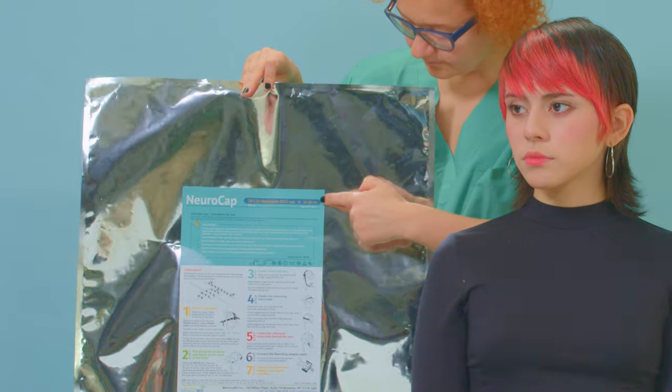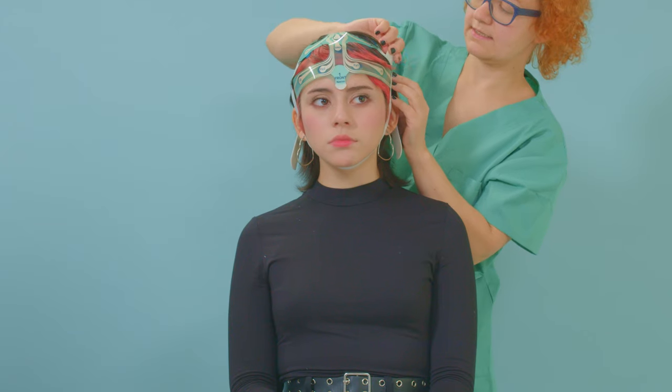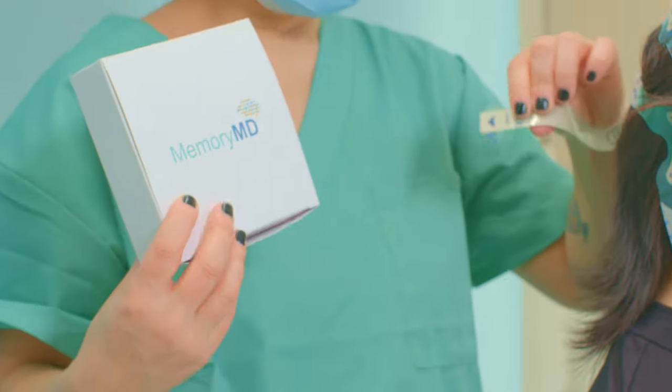Medical technology company MemoryMD presents NeuroCap: an easy-to-apply, single-use EEG headset with 19 channels and 22 pre-gelled electrodes located in accordance with the 10-20 system. NeuroCap is FDA-cleared to stay on the patient's head for up to four hours.